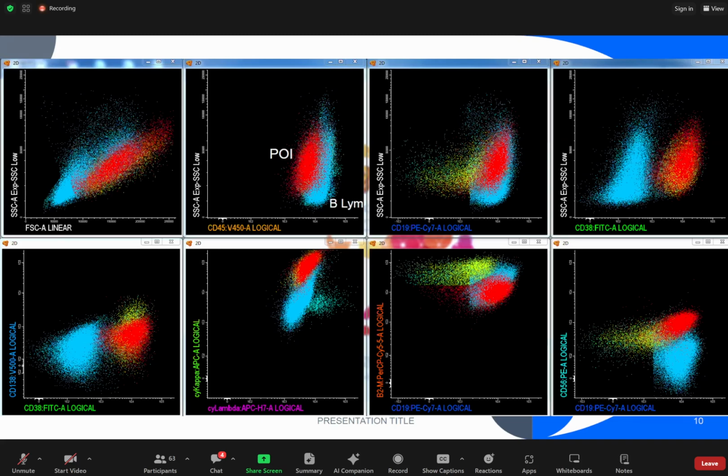Actually, initially we were thinking it's LPL. But even so, Ki67 is not that high. Yeah, moderate maybe. It's still within that sort of variation of Ki67 among LPL. Anyway, we open up the case. Has anybody seen such cases? Very uncommon.